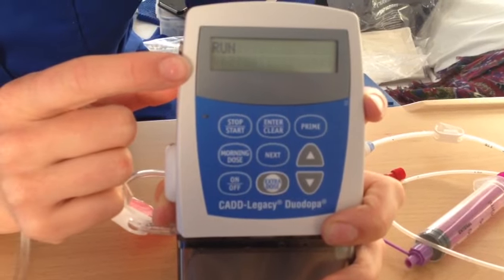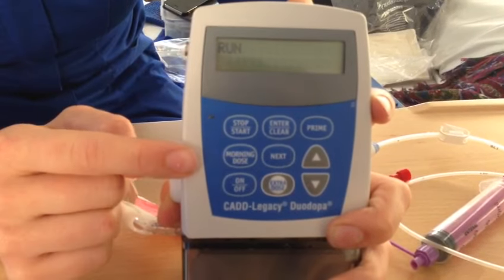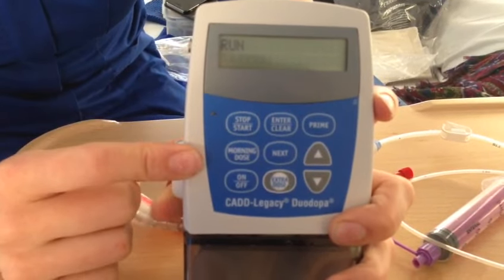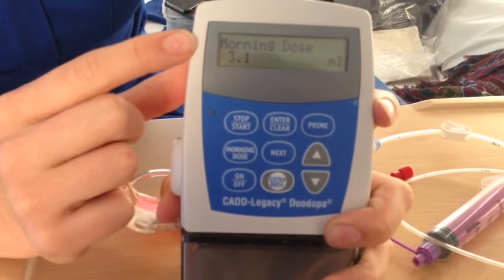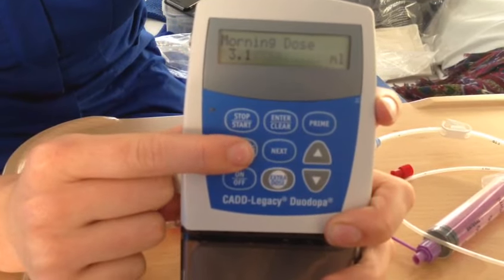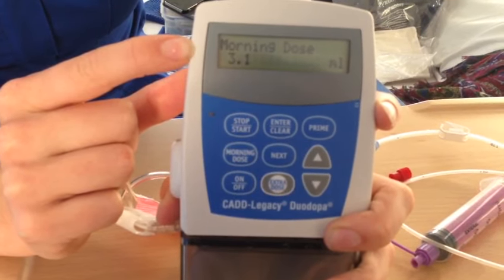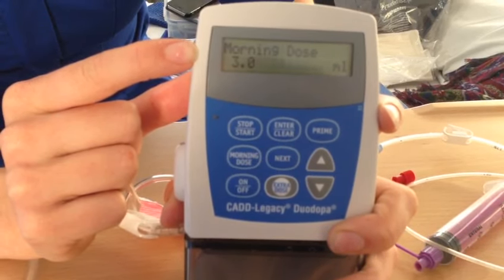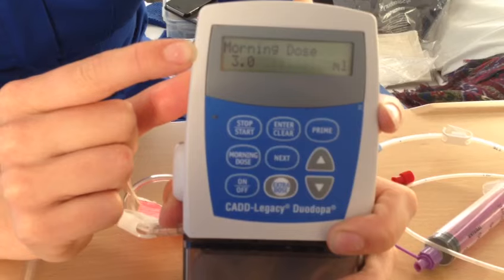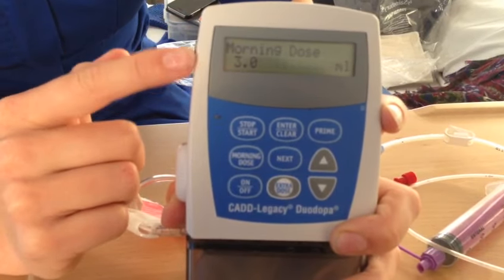When it says 'run' in the window it's ready to go. You can use the morning dose in the morning — to do this you need to press 'morning dose' and it will display the dose, then press it a second time and it will deliver the dose.